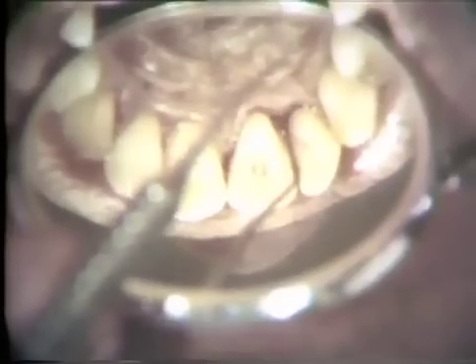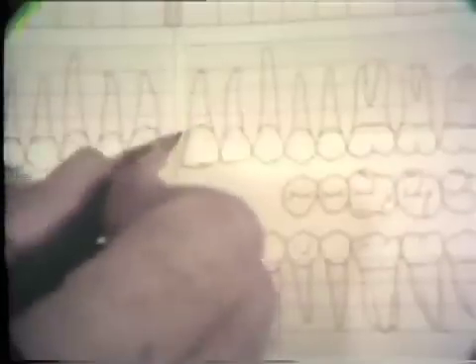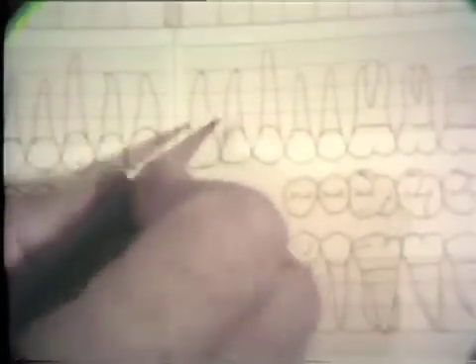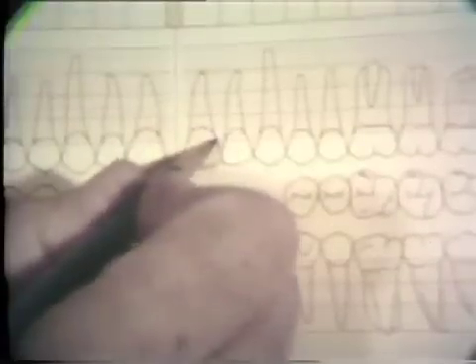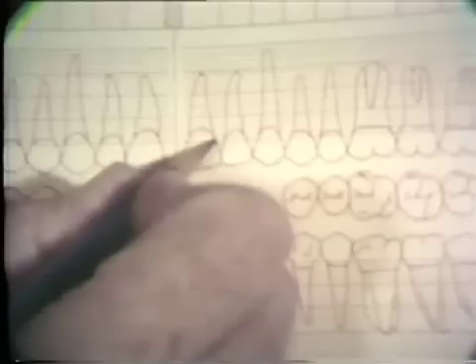Again, notice the tilt of the probe to facilitate the location of the cemento-enamel junction. The measurements for tooth number nine are then transferred to the chart, starting with the mesiobuccal and distobuccal distances between the free gingival margin and the cemento-enamel junction.